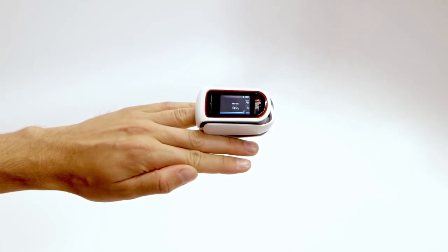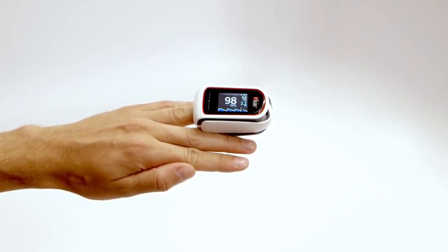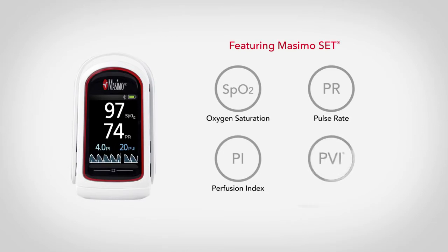After a few seconds, MightySatRx will display readings. The MightySatRx measures arterial oxygen saturation (SpO2), pulse rate (PR), perfusion index (PI), and in select models, PLETH variability index (PVI).